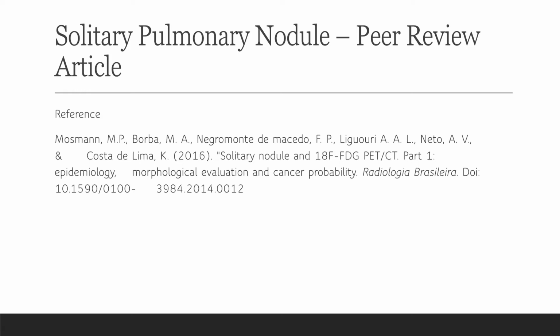This radiopharmaceutical is great for evaluating the likelihood of pulmonary nodules being benign or malignant, because it enters the cells through membrane receptors, and once in the cell's cytoplasm, it gets converted to F18-FDG-6-phosphate, becoming trapped in metabolically active cells, since it does not follow the subsequent intracellular glucose metabolism route. So, if that lung nodule on a PET-CT scan shows increased activity, it can be equated to a higher possibility of it being malignant versus benign.